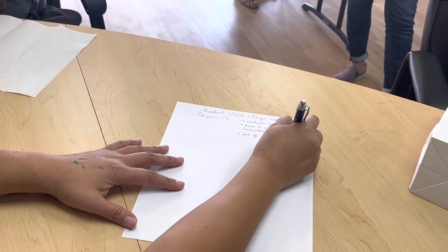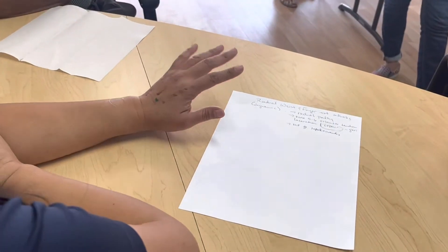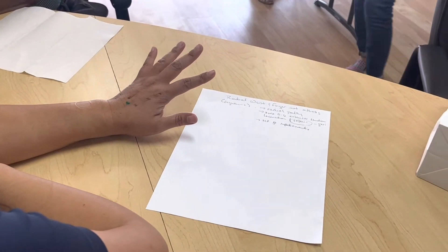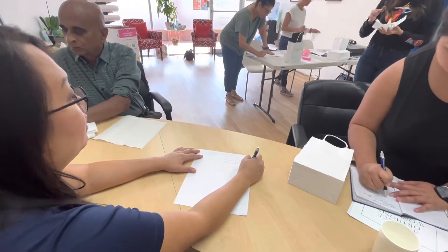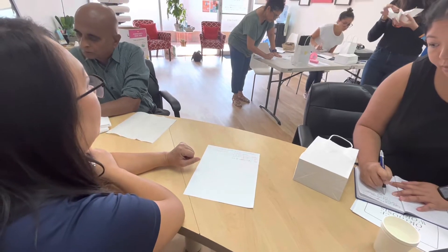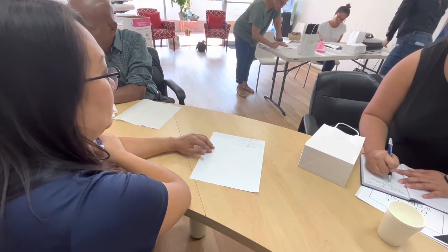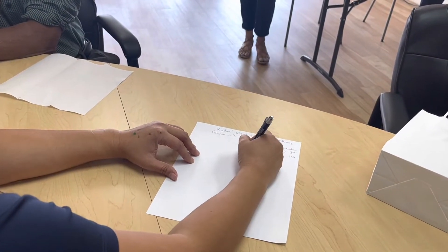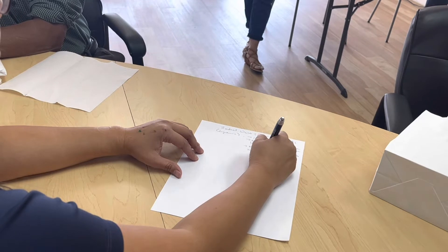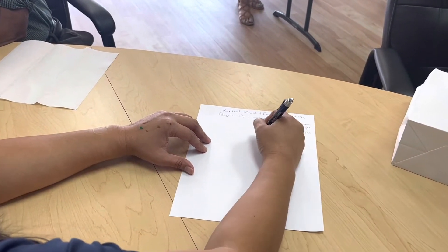MP joint replacements are going to be really an RA patient type of thing. Another indication is MP collateral ligament reconstruction.